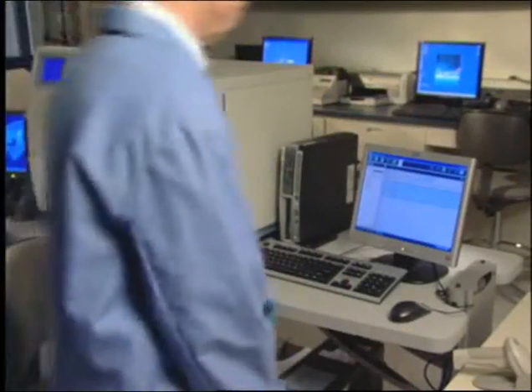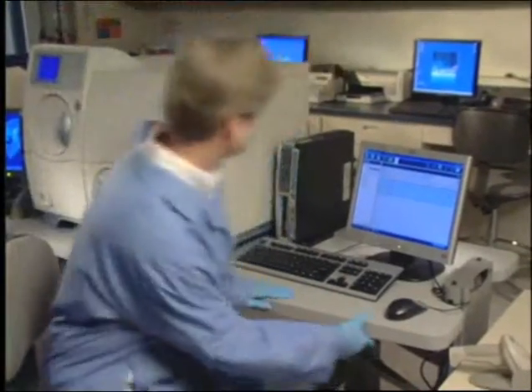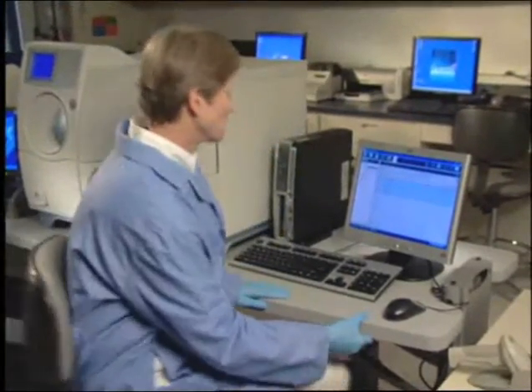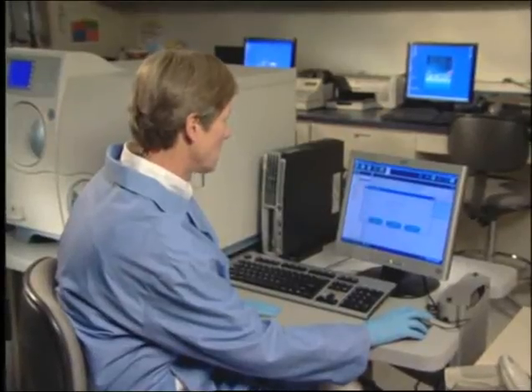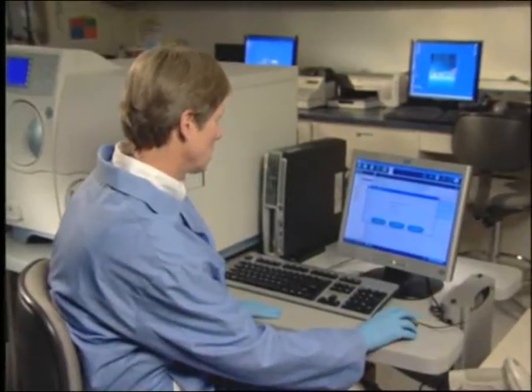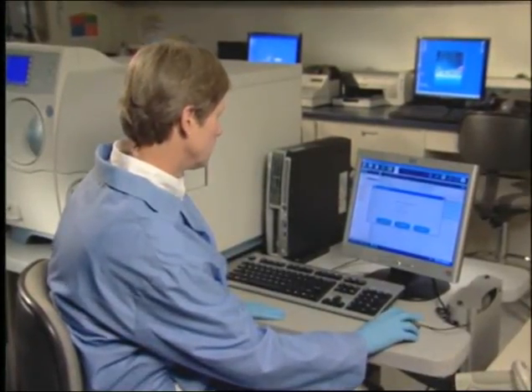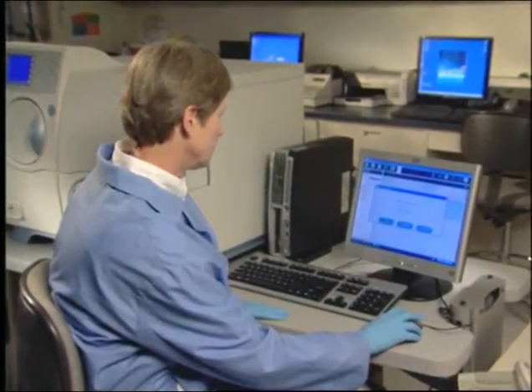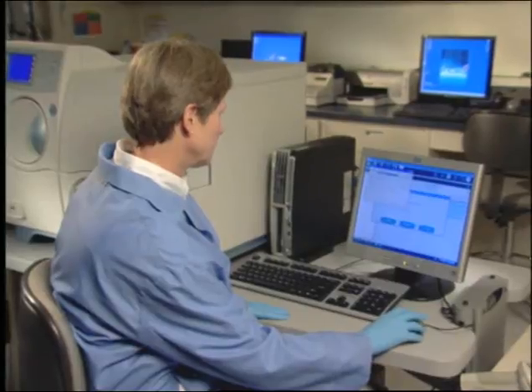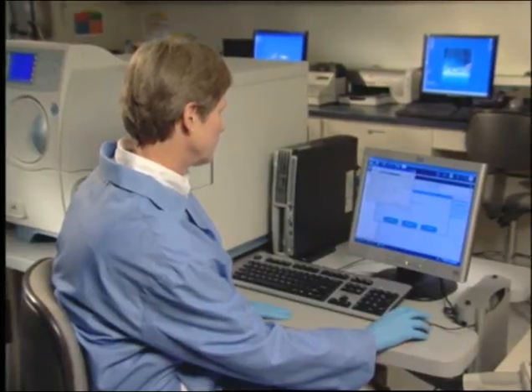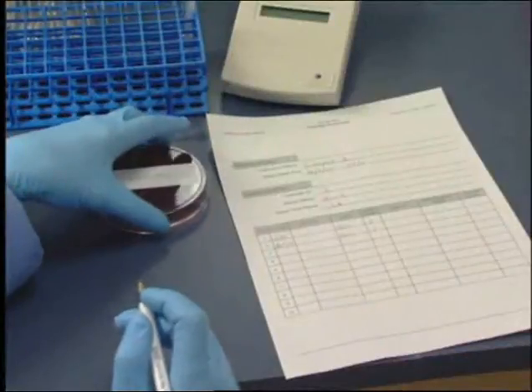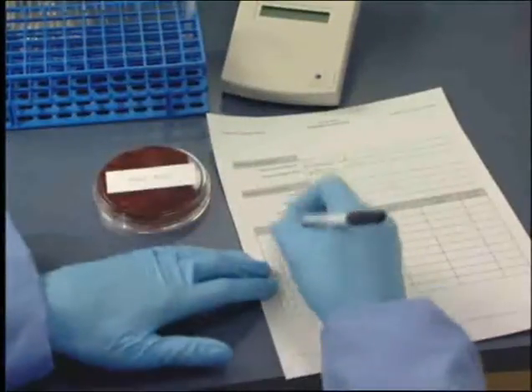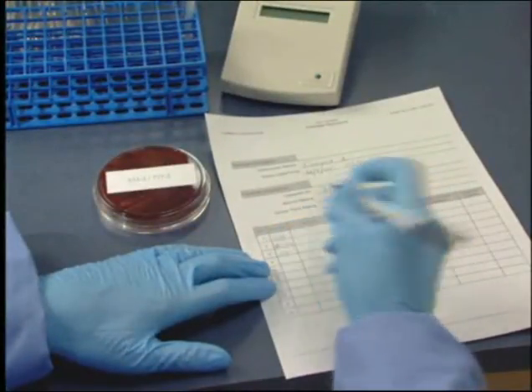When using the load and go method, print a blank copy of the cassette worksheet. At the setup test post entry screen, click the print icon and select blank cassette worksheet and print. Fill in the worksheet information before, during, or after card setup.